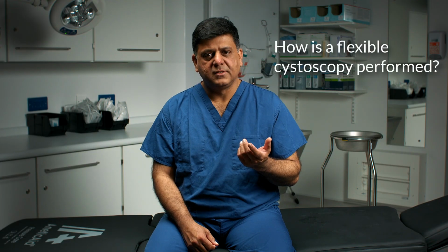How is a flexible cystoscopy performed? Your consultant and nurses will ensure you are comfortable. They will place a sterile sheet over the lower half of your body before your specialist applies a local anesthetic gel to your urethra or water pipe to numb it. Next, your consultant will insert the cystoscope into your urethra and, using water to guide safe and comfortable passage, gently move it into your bladder. If you wish, your consultant may share the screen with you and explain what is happening during the cystoscopy.